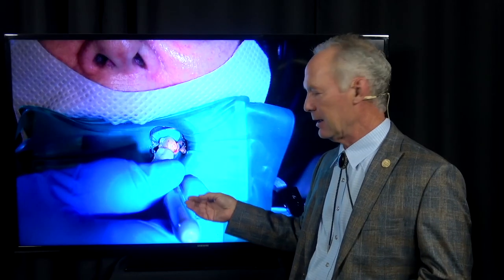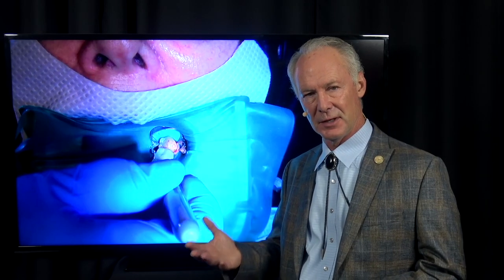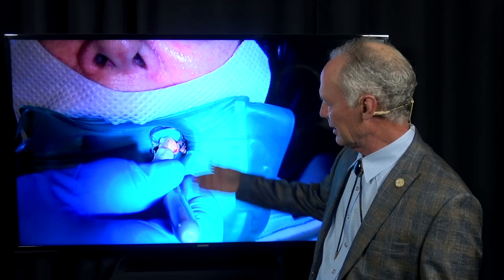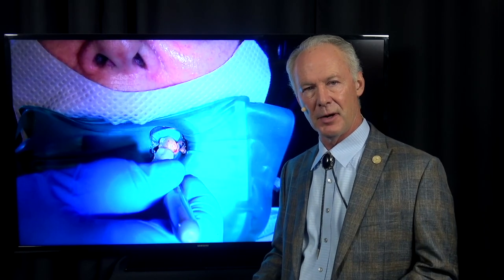What does a rubber dam do? The big thing is it keeps any large pieces of whatever you're cutting from being aspirated. In this case I'm cutting and removing that crown into two or three pieces — I don't have to worry about a piece being aspirated by the patient. It also keeps the lips, tongue, and cheek out of the way, making your assistant's job and your job much easier and less stressful. This rubber dam method keeps saliva off the tooth and only takes about 15 to 20 seconds to place.